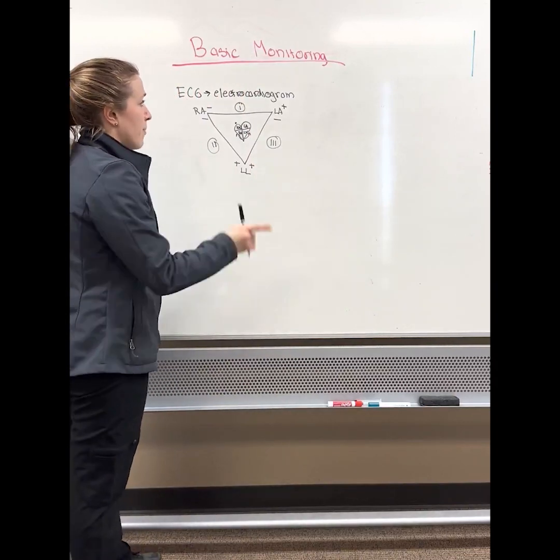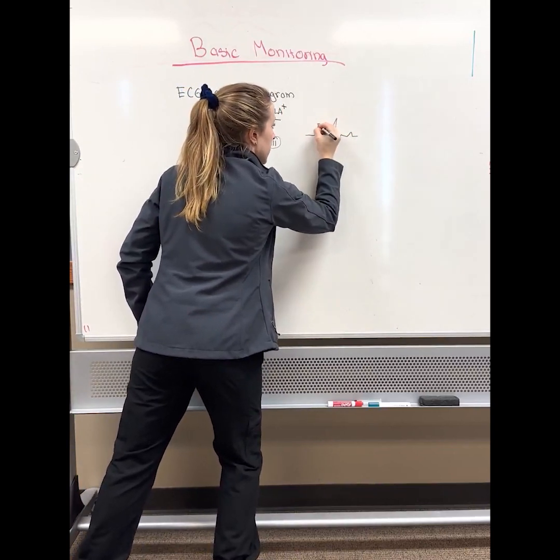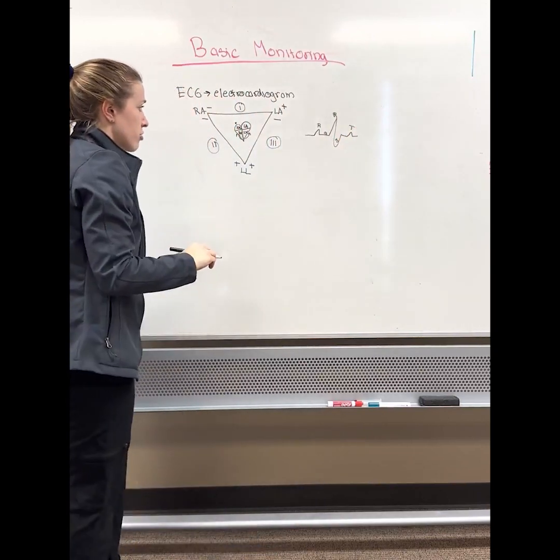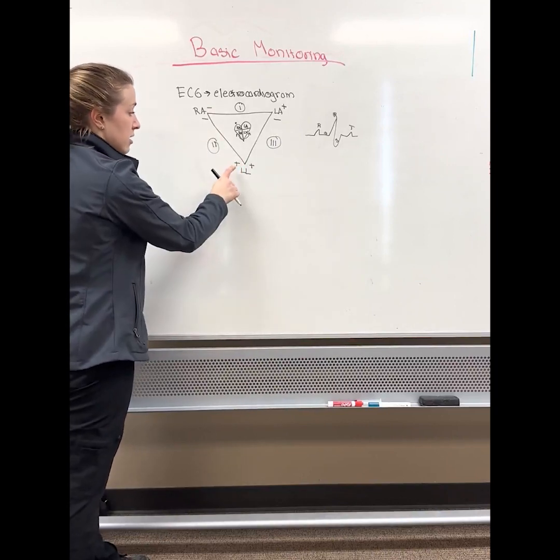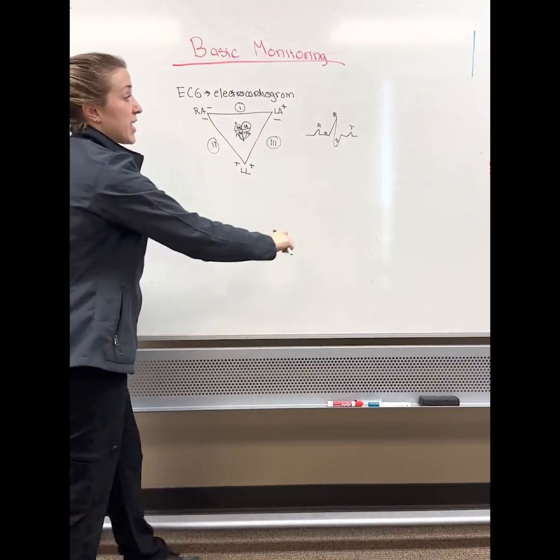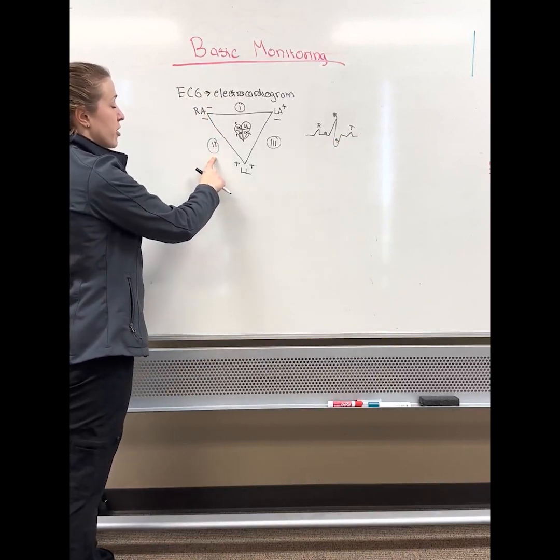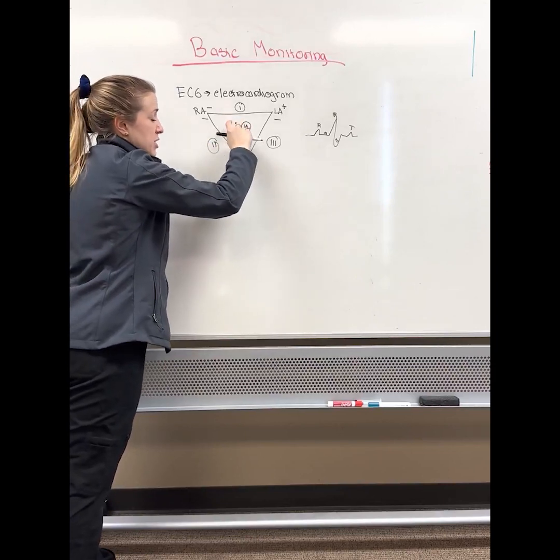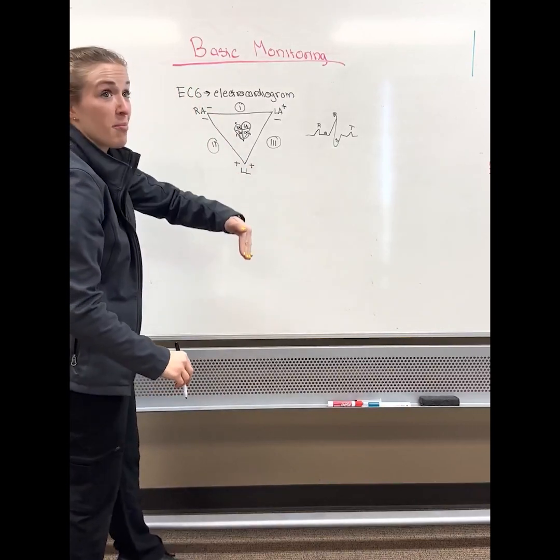And basically what's going to happen on your ECG, let me just draw this out here. PQRST. That's what you usually see on the monitor, right? When the heart depolarizes towards a positive lead, like this or like that, when it depolarizes in that direction, you're going to get a positive deflection on the monitor. That's why when we set lead 2 on the monitor, which is read right arm to left leg, negative to positive, the heart depolarizes top to bottom, it depolarizes towards the leg, and you get a positive deflection because you're looking at it from that way.